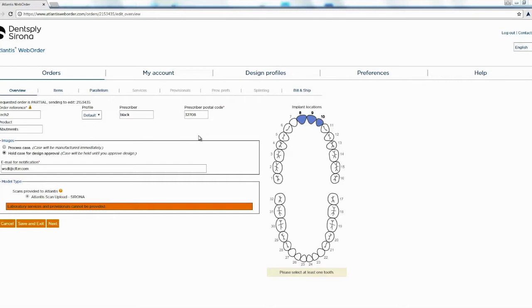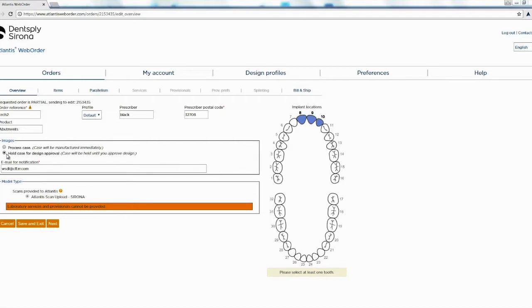We'll go ahead and fill out our prescription, put the prescriber's name, zip code. Here it asks us do we want to process the case immediately or do we want them to send us the design for us to look at and approve. I usually click on hold case for design approval, put your email and hit next.